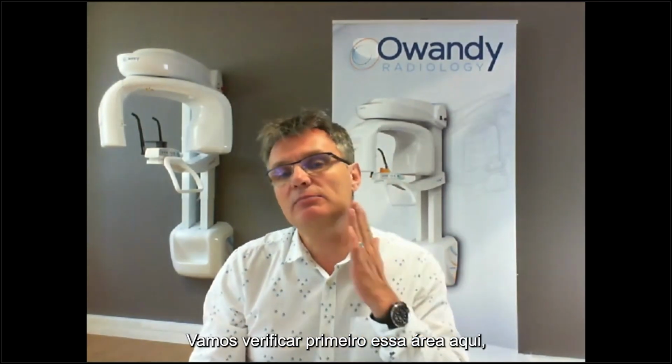The first step is to check the patient within 4 actions. We'll check first this area here, and then that area here, and that area here. 4 actions. This is very fast. Each time you do a CBCT, it's a quick tour of the patient.